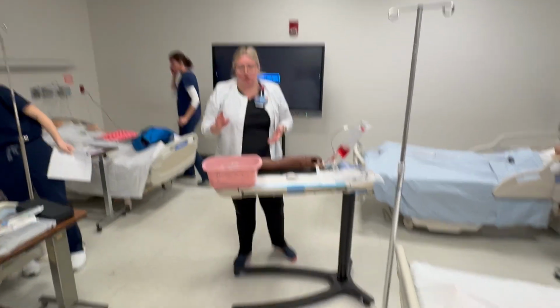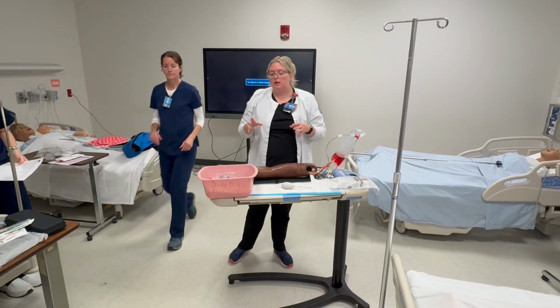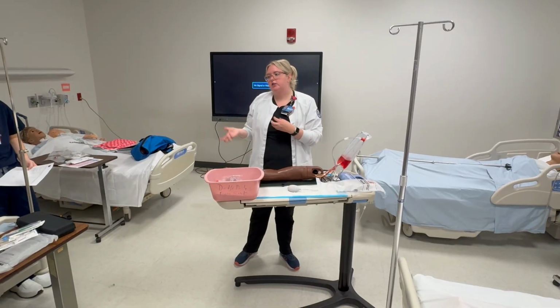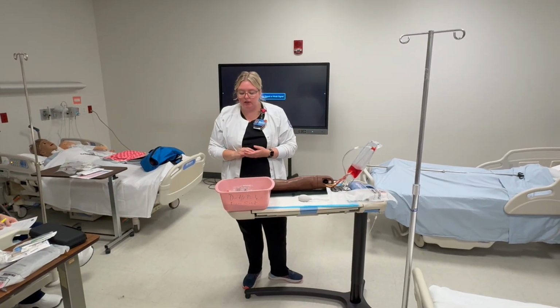So we're going to gather our supplies. We're going to check the order, wash our hands. I think the rubric does a really good job at showing you when you're in the med room versus when you're at the patient's bedside. So you're going to gather your supplies.